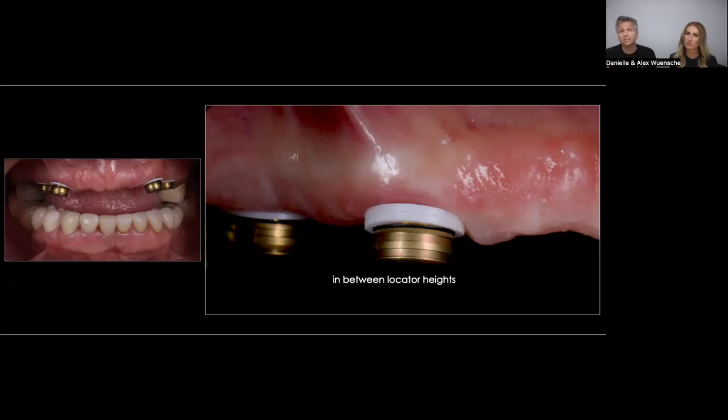That's the biggest concern many clients have. They say, oh, I don't want to do the intraoral pickup because I'm afraid the denture locks in and I have to cut it out and we have to redo the case. Honestly, I don't remember any client who ever had that problem when I advised these wide rings. It's a very, very rare scenario that an overdenture would lock in when you do an intraoral pickup if you follow the protocol. That's very important. If you follow protocol, nothing will happen.